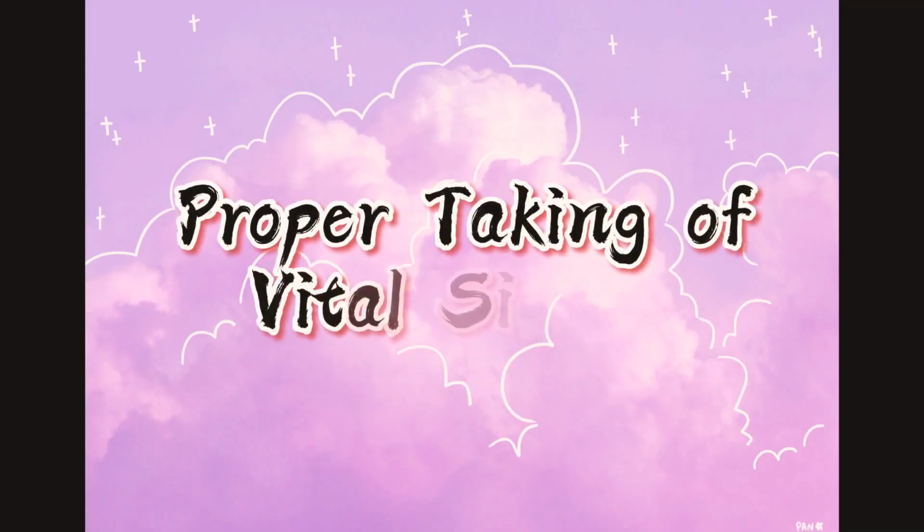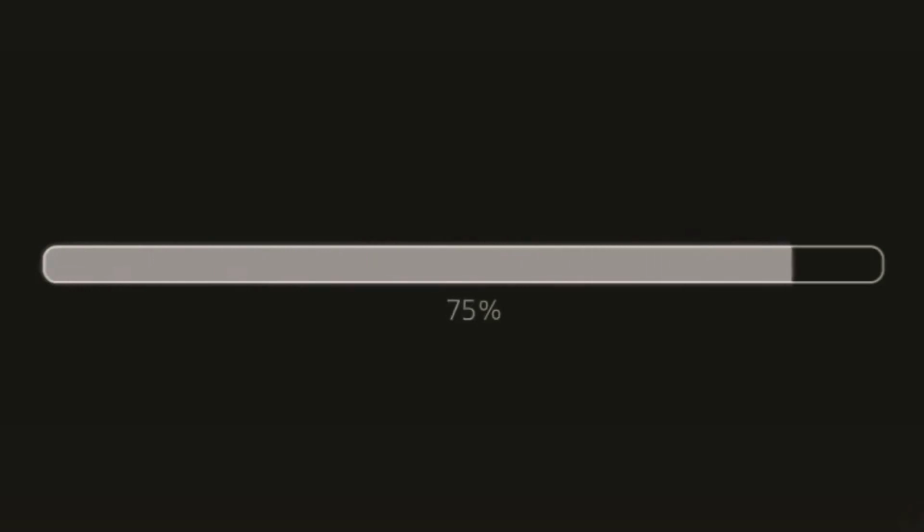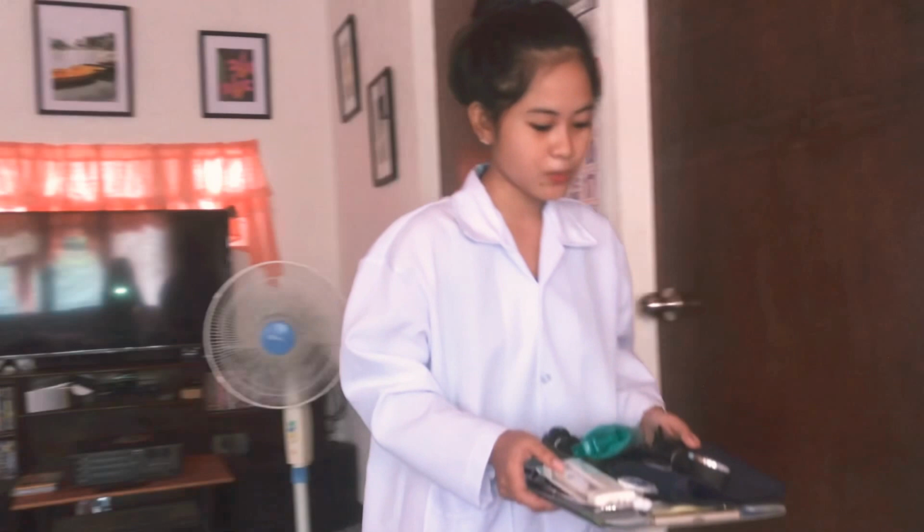College and University of Visayas. I'm making this video to demonstrate to you the proper taking of vital signs. First, assemble your equipment.